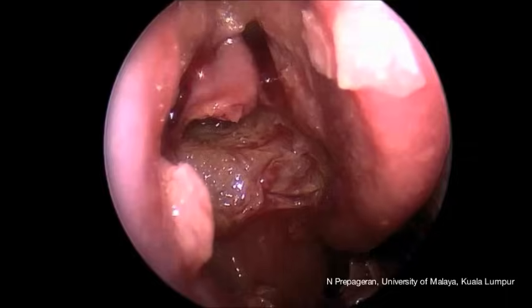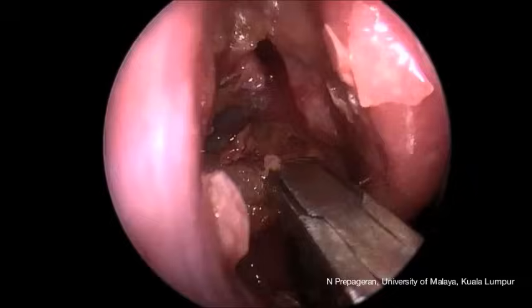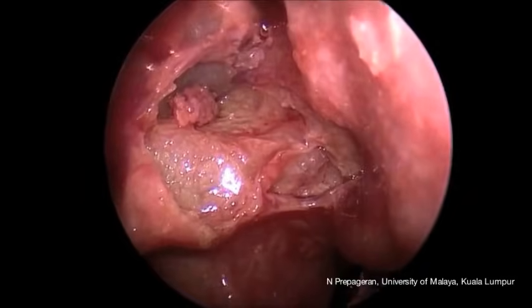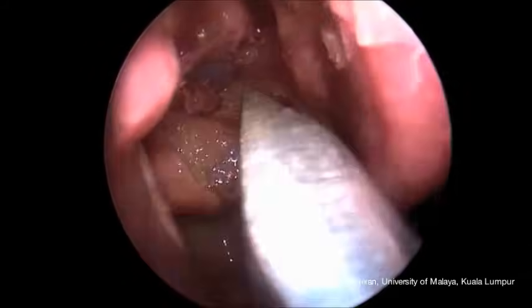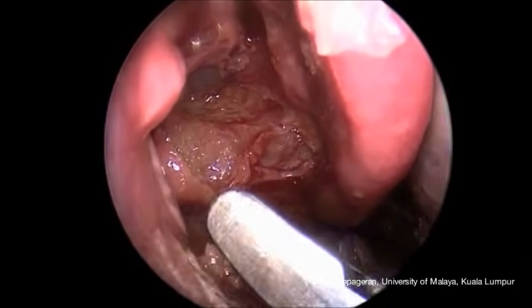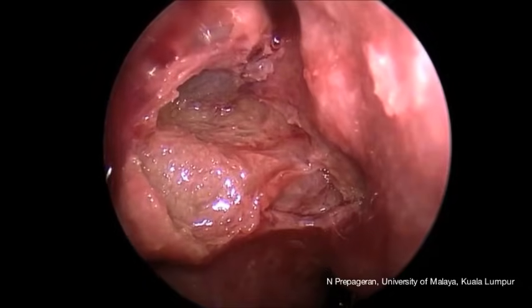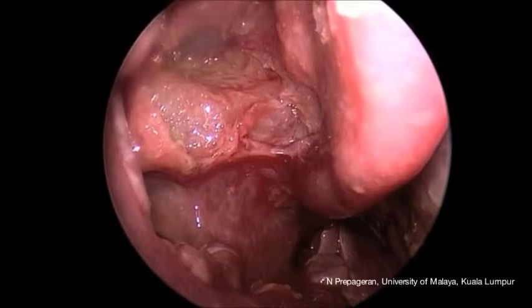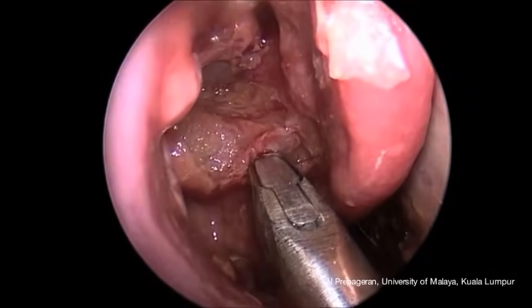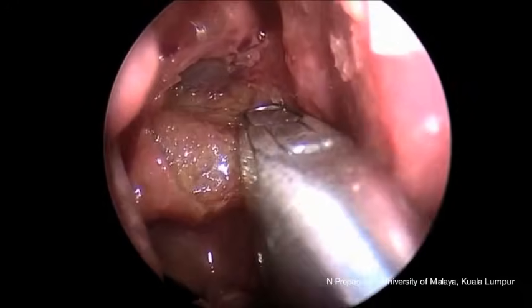You can visualize the ground lamella here, which is gate number three. Let me remove the upper part of the bulla as well so that there's complete resection of the bulla ethmoidalis or anterior ethmoids. This shows us very nicely the ground lamella, and you can actually see how the middle turbinate turns inside to form the ground lamella, which is divided into the vertical and horizontal portions. Behind the ground lamella will be the posterior ethmoids.